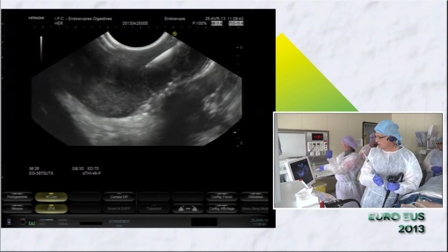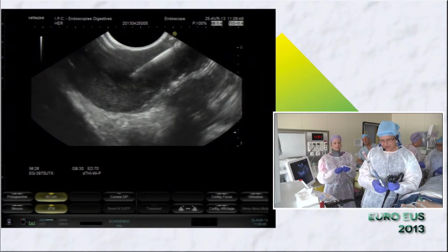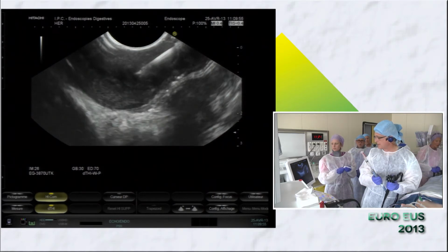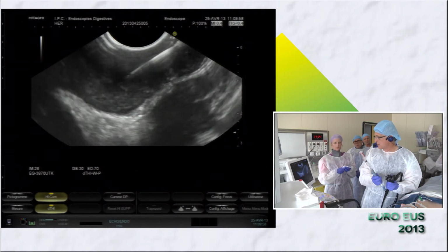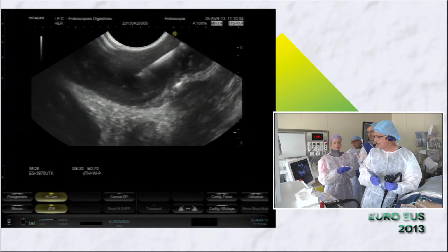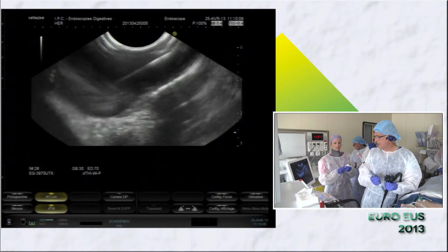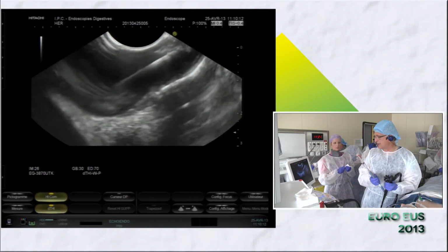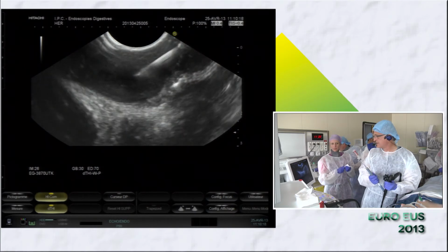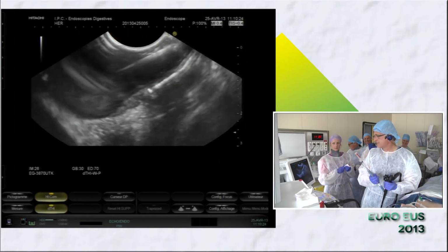We are using suction during the puncture. I know that Anan is here and he never used suction, I think. But this is the rule here in Marseille, to use suction during the puncture. This is what we do too. And we see very well that it's a solid mass, not very hard. Maybe among the moderator or the audience, somebody has an idea about the diagnosis? Maybe it's thick mucin or something like that. Do you think it could be a solid myoma? Yeah, it might be.